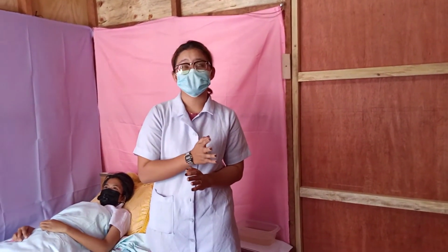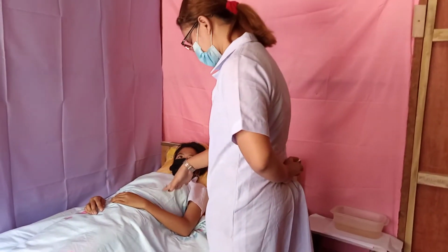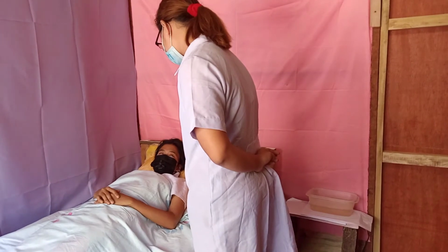The second procedure is the client's physical status. Rationale: to ensure that the client is at rest and to identify the affected side of the client. So, ma'am, saan po ba yung masakit sa may masakit po ba dito? Kayo dito sa kabila? Sa kabila naman po. So, saan po yung masakit? Wala.